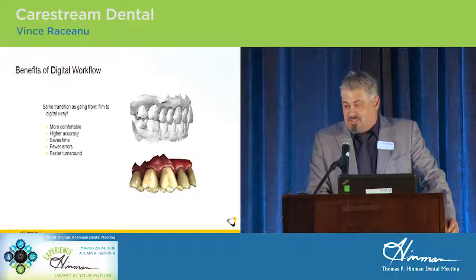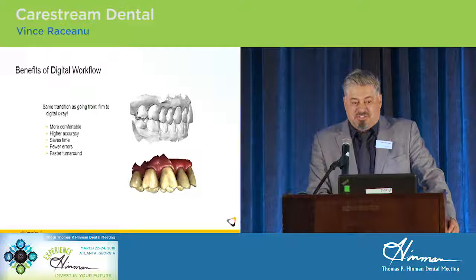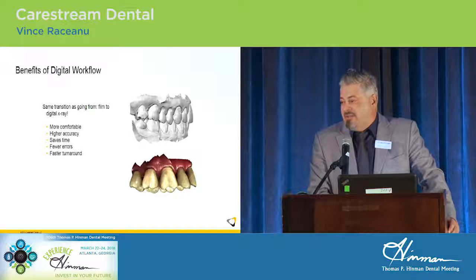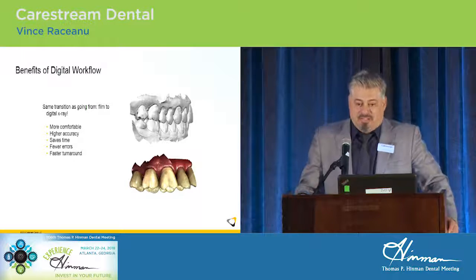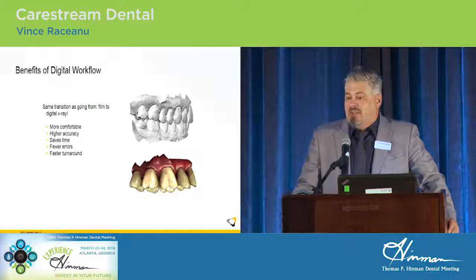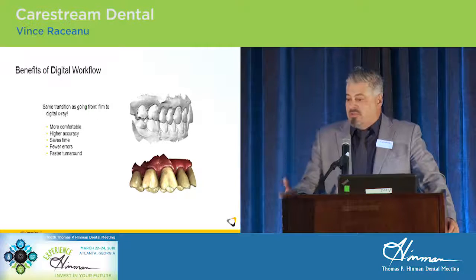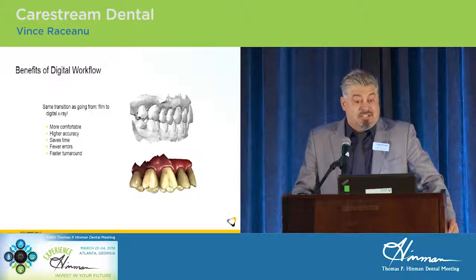So I just mentioned this. Higher accuracy has really been something that's been well documented. You can easily just Google that yourself and do a bunch of reading on why it works and why the 16 or so human steps that we're eliminating when we're taking a traditional impression. And with digital, you don't find out after the fact that there is a problem with the impression. So if you pull it out of the mouth and there's a void, there's a bubble, there's something, what do I do now? Do I take another one?